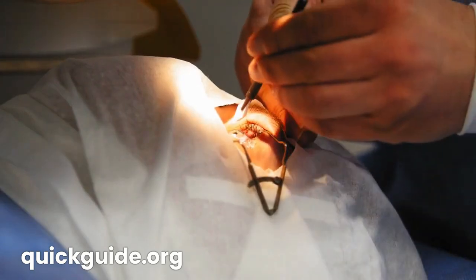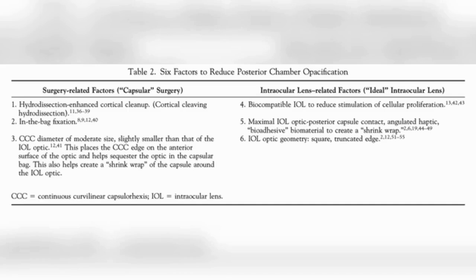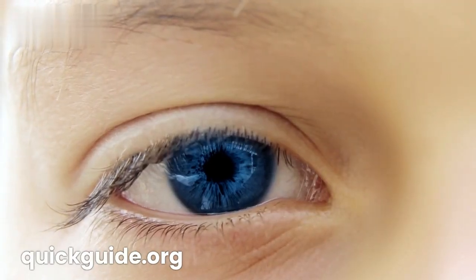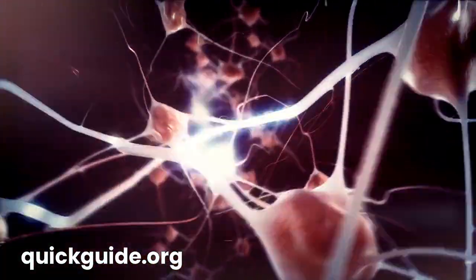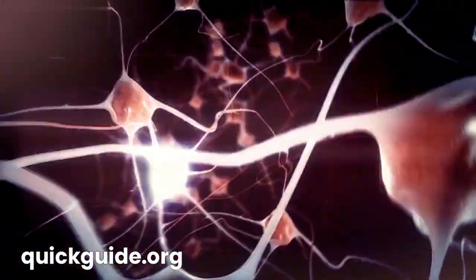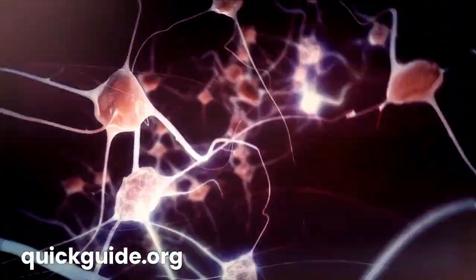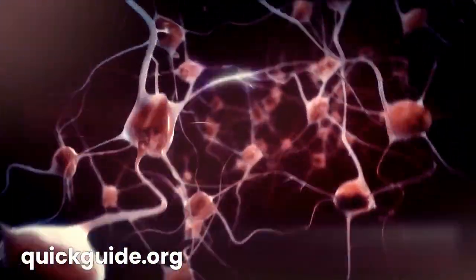The 3 IOL related factors that would contribute to less PCO are capsular biocompatible material, square edge design, and adherence of IOL optic to posterior capsule. One way of reducing cell migration from the equator of the capsular bag to the posterior capsule is to make the IOL posterior optic adhere to the capsular bag. This would ensure less space for cells to migrate and grow on the posterior capsule.